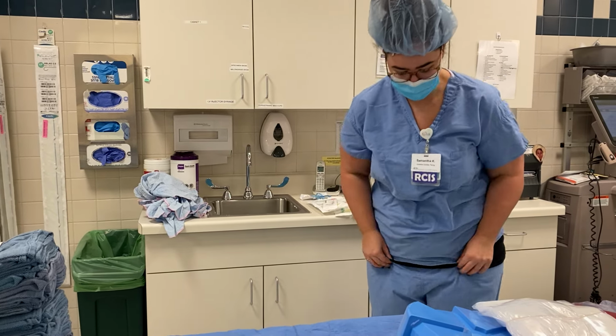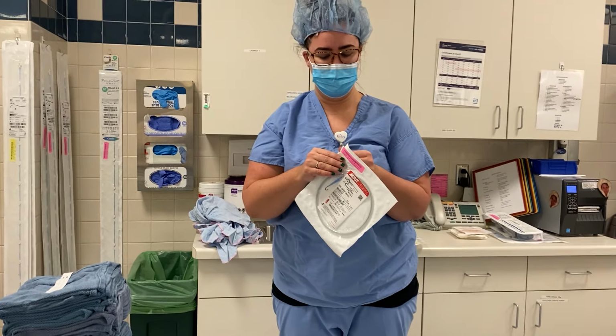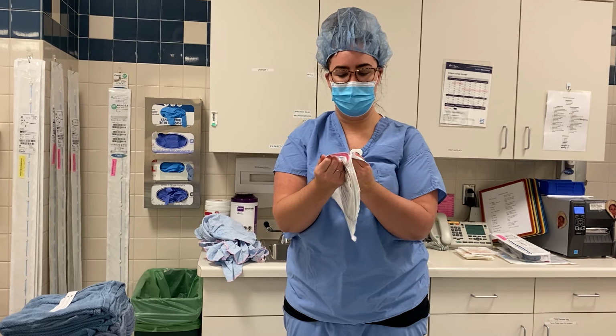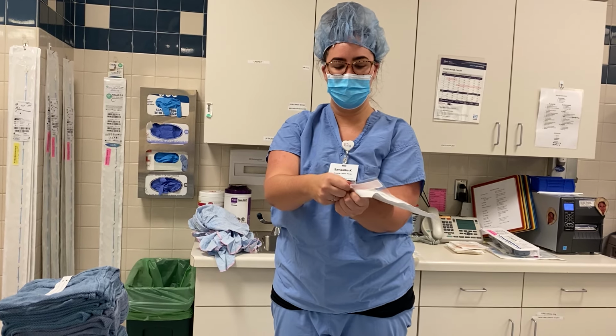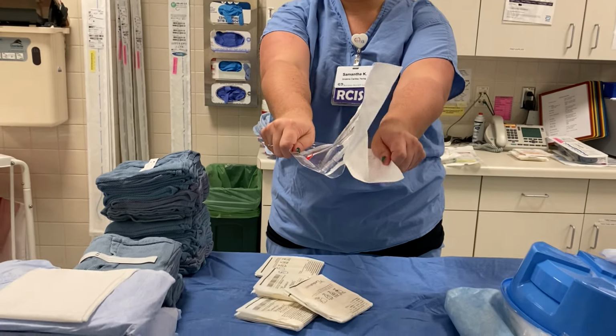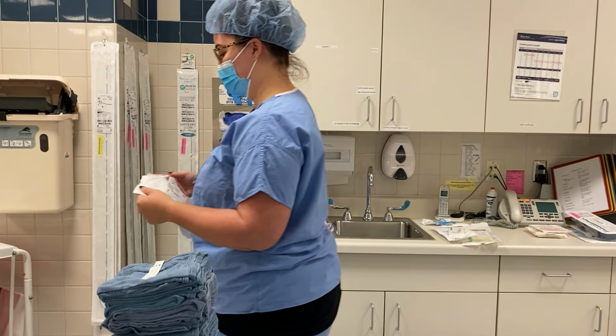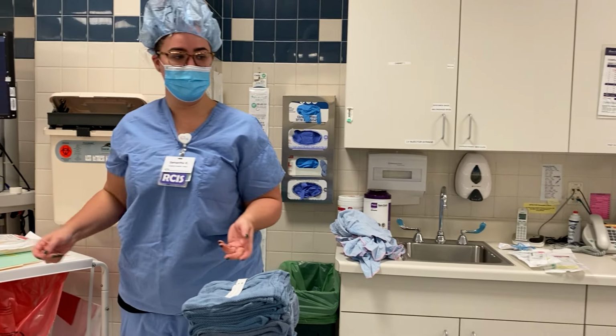And the next thing that we'll open is our wire. So again, I'm just gonna peel it open just a little bit to get it started. I'm gonna hold it over the table and just peel apart so that it drops. So the next thing is I'm just gonna scrub in to set it up.